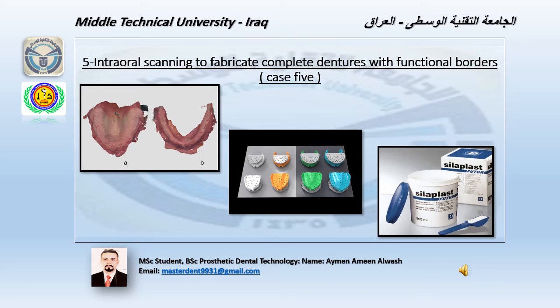This data will transfer directly to the monitor when we record the scanning inside the patient's mouth. And this technique avoids the traditional way that we are used to in the clinic, and we will have a specialized type of tray. It's called a centric tray. This technique is the same as the closed tray technique.